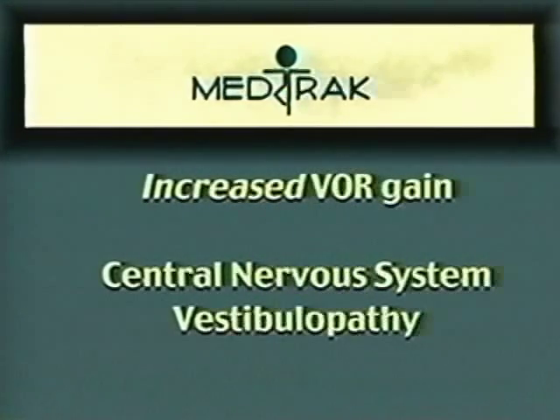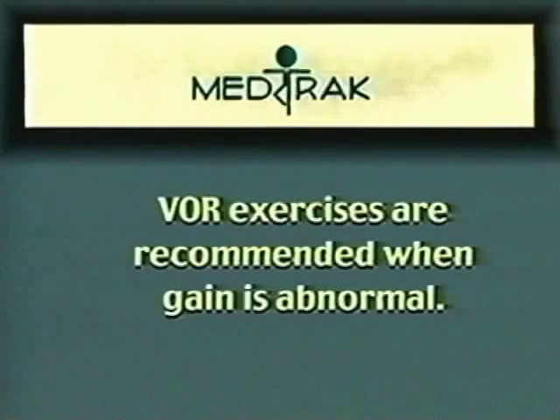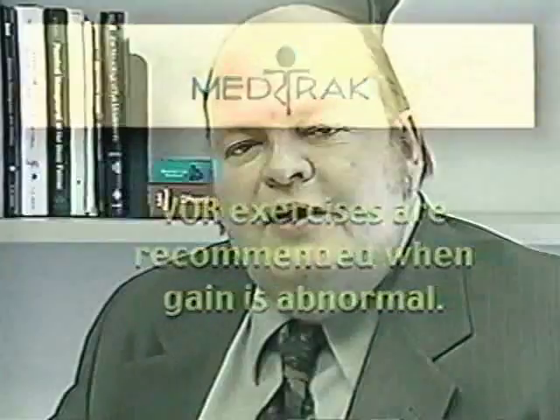Increased VOR gain is consistent with a central nervous system vestibulopathy, while decreased gain is generally consistent with peripheral vestibular pathology. Many elderly patients and closed head injury patients exhibit increased VOR gain, often as the only abnormal finding in the VNG test battery. VOR exercises are recommended when gain is abnormal, and after correlating the physical examination, patient history, and other medical tests and laboratory studies.